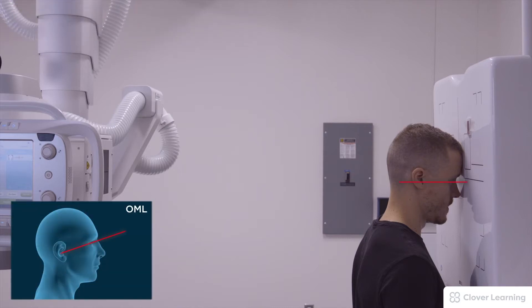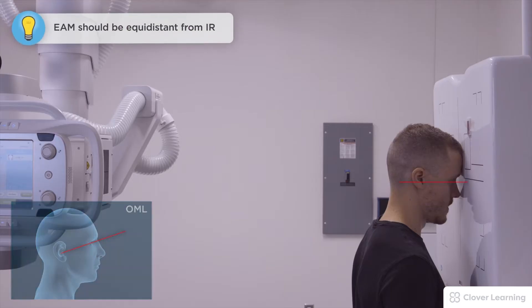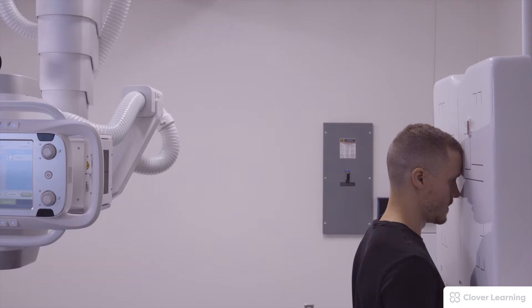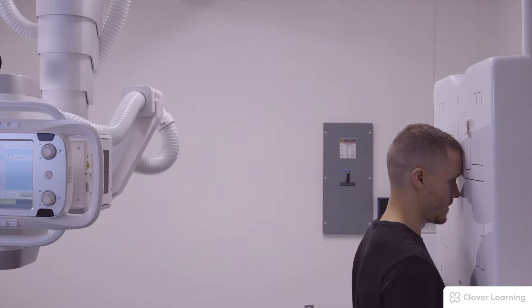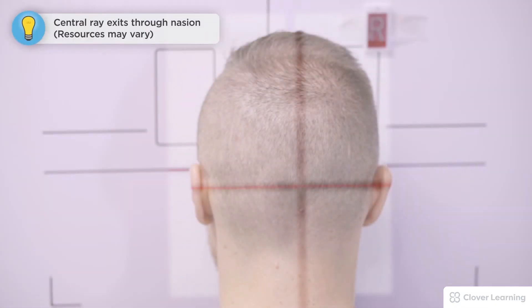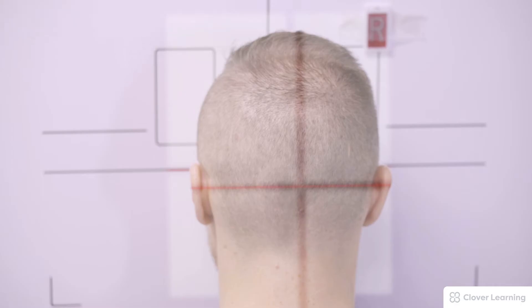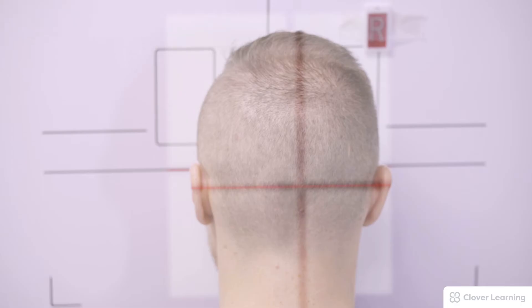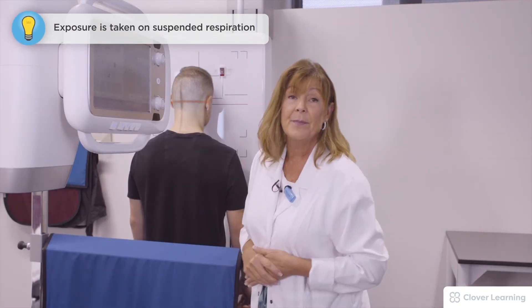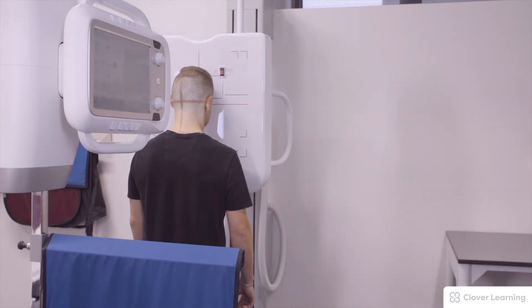I have made sure that his external auditory meatus, the EAM, is equal distance from the bucky so that there is no rotation. The central ray exits out through the nasion and I have collimated a half an inch to an inch around the shadow of his skull. I have placed a right marker on the right side and he is shielded.